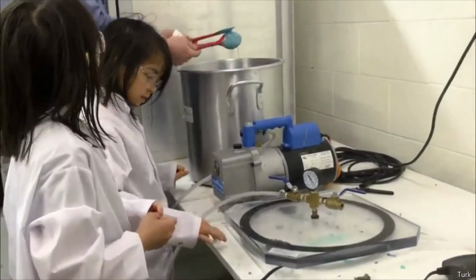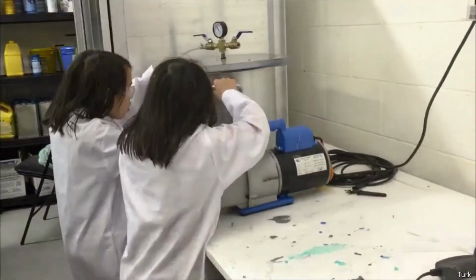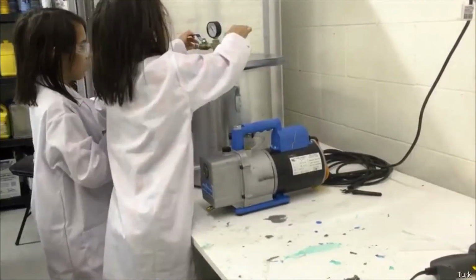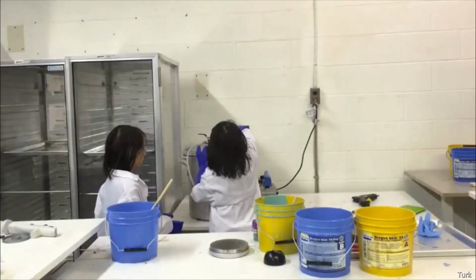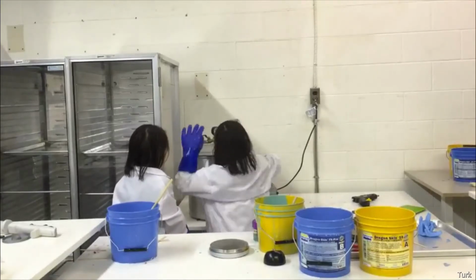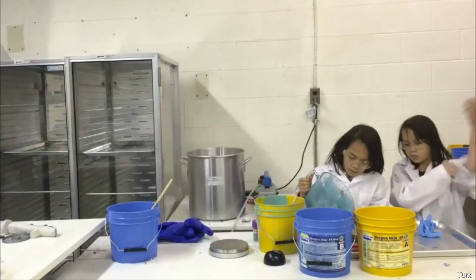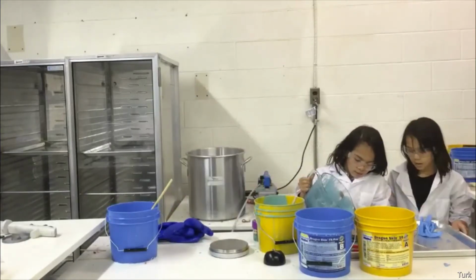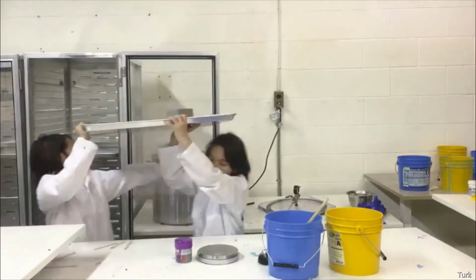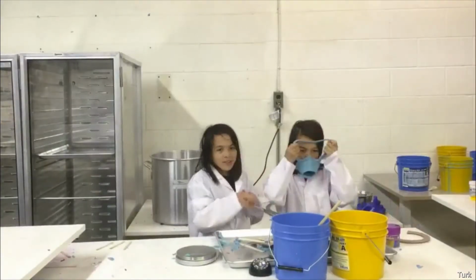Then we put it into a vacuum chamber to degas. That means to take out the air. When the bubbles slow, it's time to take it out, releasing the pressure slowly. We pour it into the 3D mold, then put it into the oven to speed up the curing process.